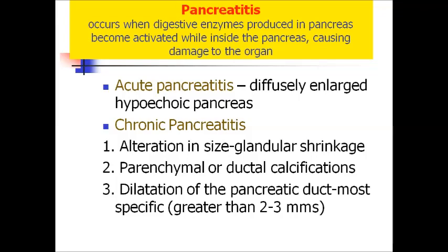Only enlargement of pancreatic parenchyma in cases of acute process, and in chronic cases there are several symptoms: alteration in size, glandular shrinkage, parenchymal or ductal calcification, dilatation of pancreatic duct.